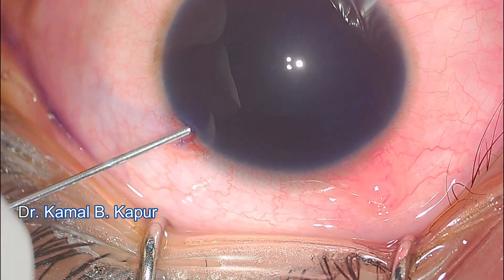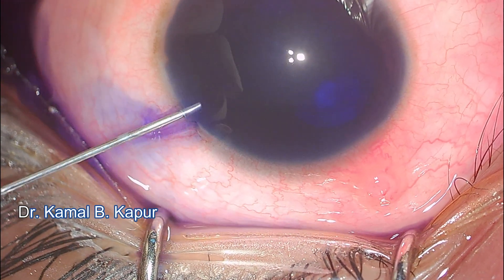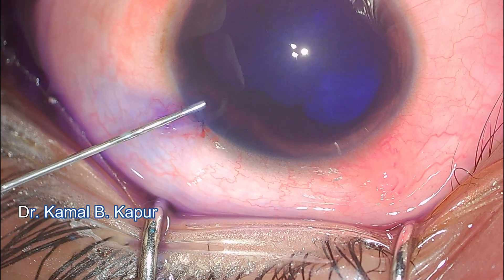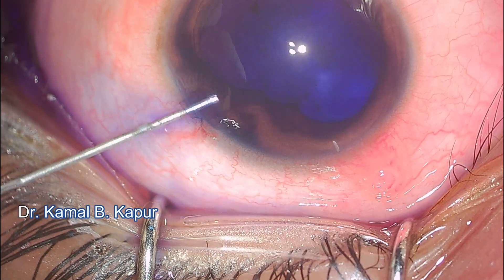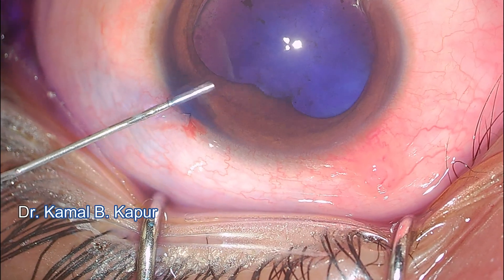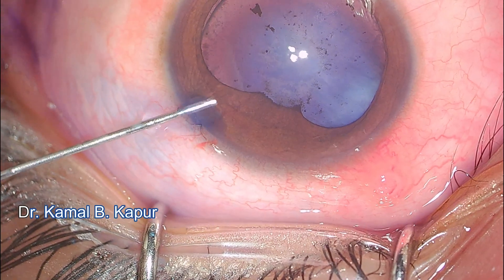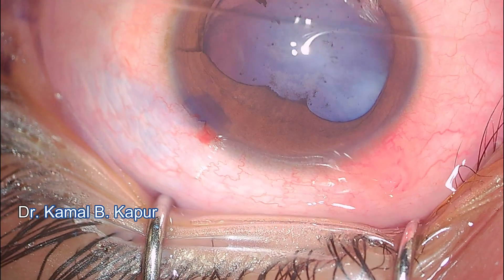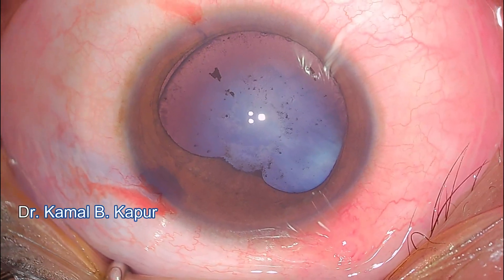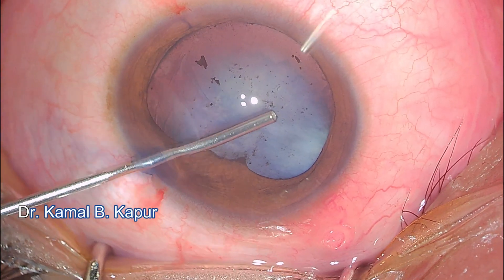The trick when injecting trypan blue dye in this patient is not to over-inflate the dye, and even when washing it out, do it very carefully and slowly. Sometimes the dye can pass through the subluxation into the vitreous, resulting in loss of red glow and complications. A very controlled, slow injection of the dye was done, and the washing out was performed in slow bursts, dipping the scleral wound.